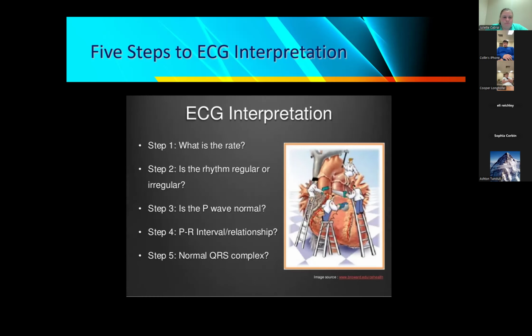I've got the chat pulled up here, so if your mic doesn't work, or you don't want to talk, just type it in there for me. Okay, gotcha. It is sinus arrhythmia. Now, remember, sinus arrhythmia is dependent upon our breathing, and we'll be able to actually cause sinus arrhythmia when we get to the point in the semester where you guys are going to hook each other up on EKGs and do EKGs.